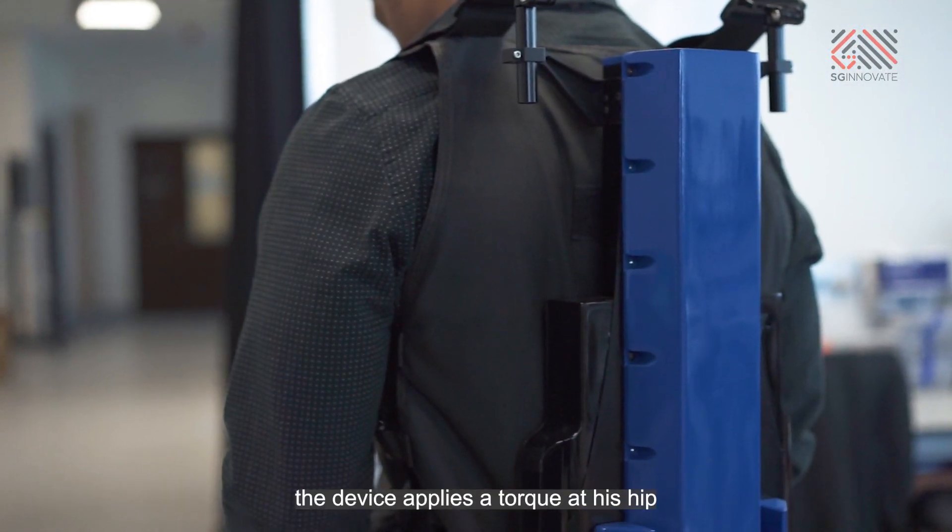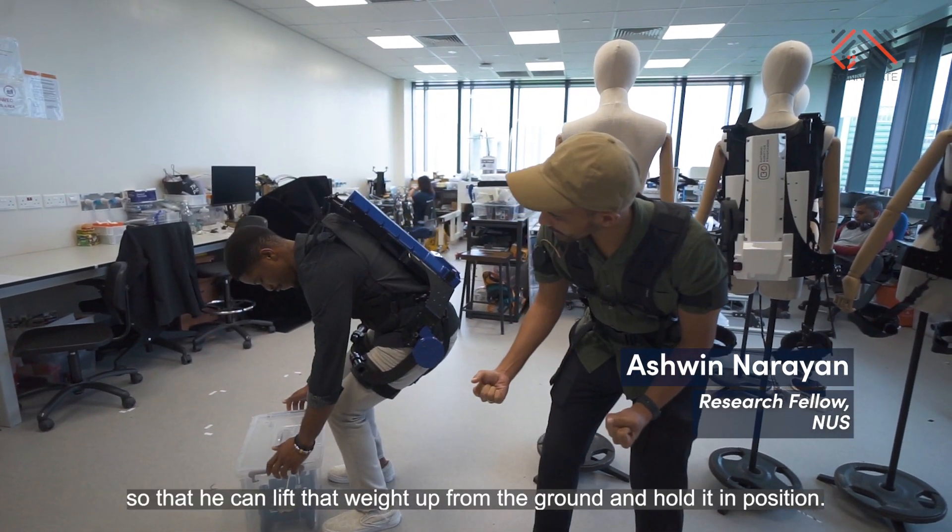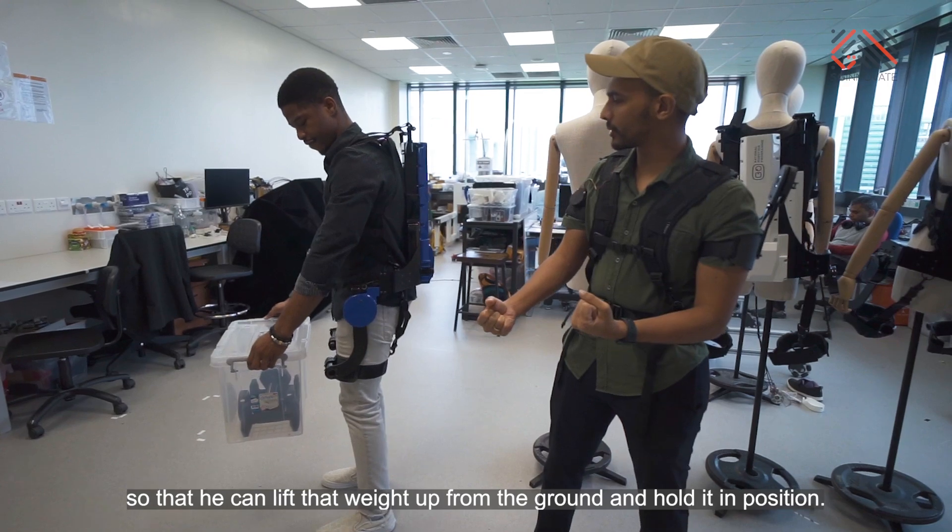You can see that as he lifts, the device applies a torque at his hip so that he can lift that weight up from the ground and hold it in position.